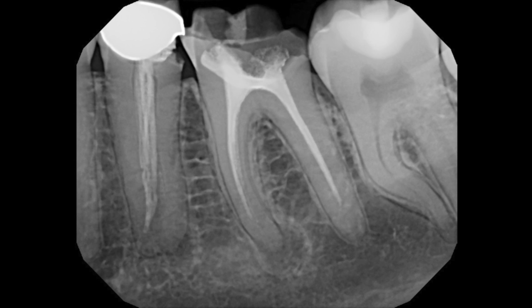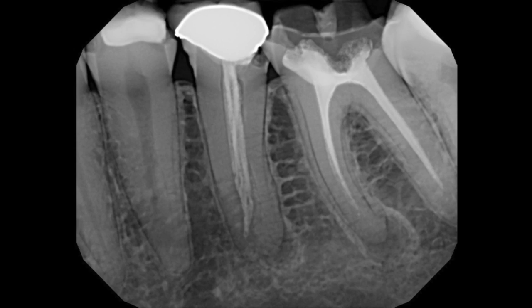A young female patient was referred to me for consultation regarding either endodontic retreatment of teeth 19 and 20, or their extraction and replacement with an implant. Both teeth were treated overseas about five years prior to this radiograph, and were both symptomatic at the time of her presentation to my office. Poor coronal restorations were present as well.